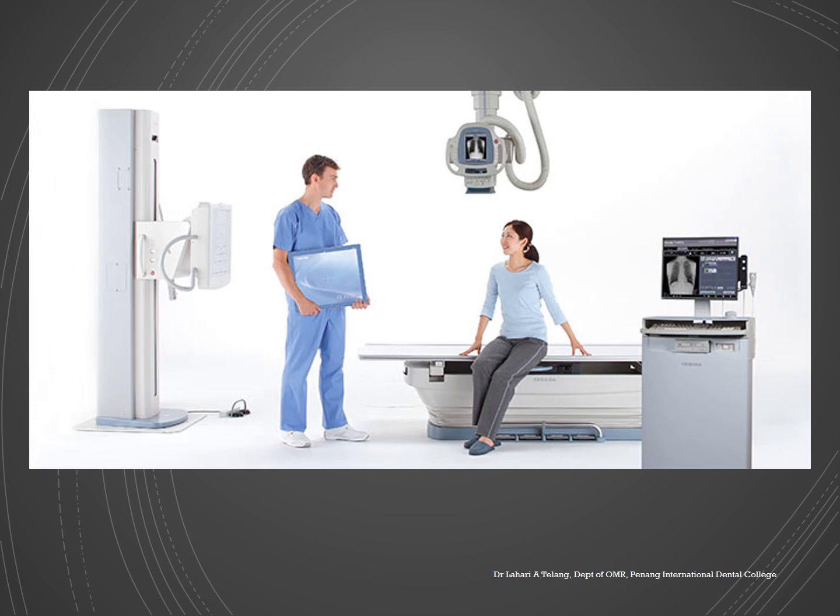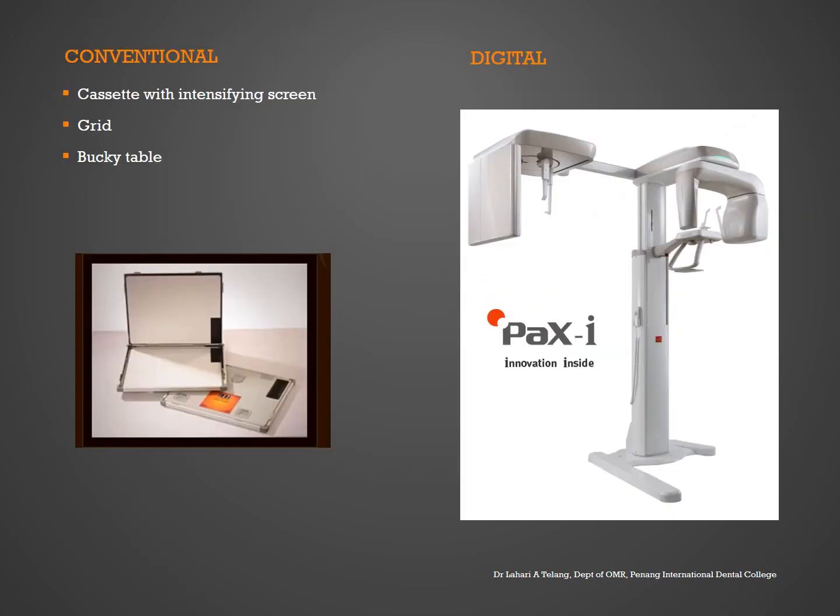In a dental setting, of course, it is different: the patient is standing in a setup which enables extraoral radiographs, and all the radiographs that I'm going to talk about can be done in the dental setting using the cephalometric section of the imaging machine. So this is the panoramic section or the CBCT section, and this section is the cephalometric section.